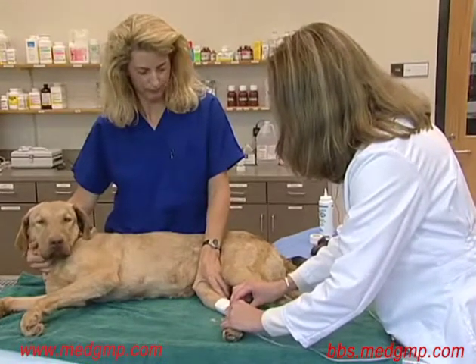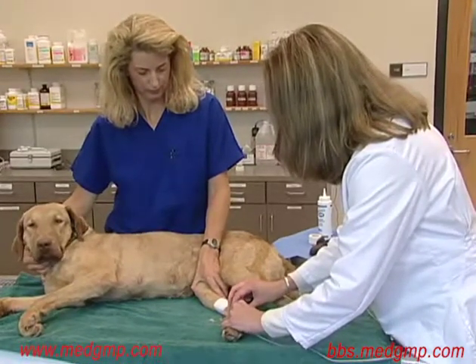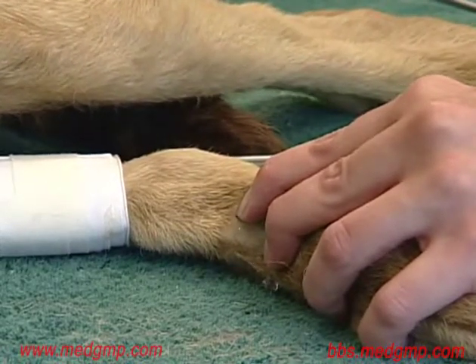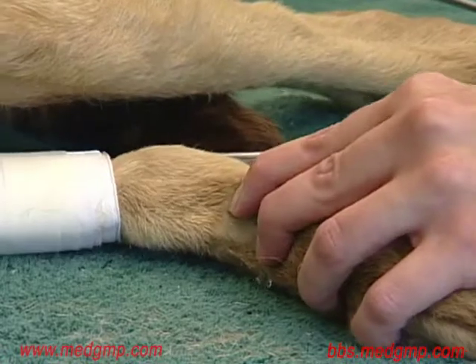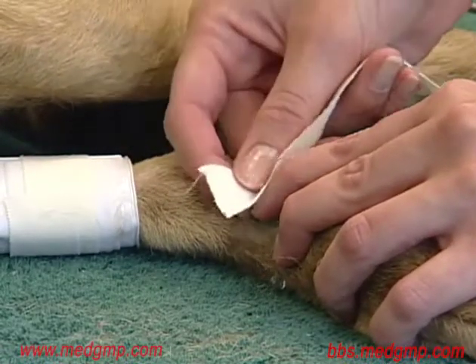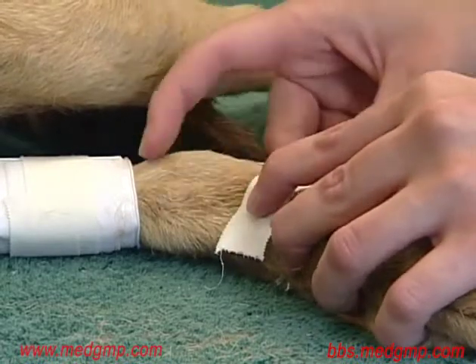I'm now going to move the probe until I can locate the artery. Once we've obtained a good pulse and can hear the pulsation of the artery very well, we can go ahead and tape that in place so as to maintain the position.